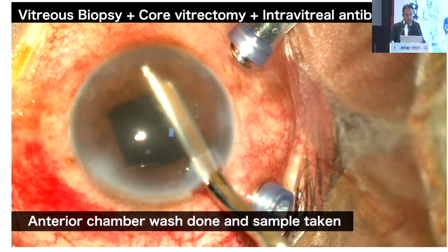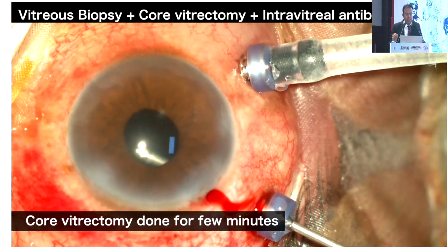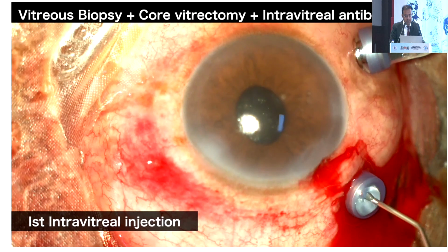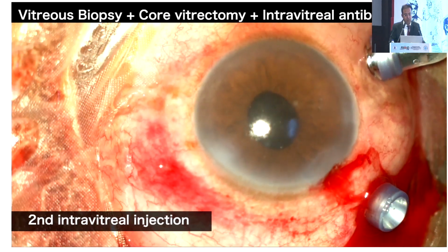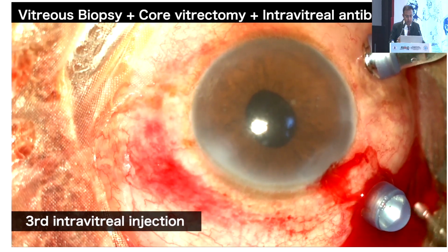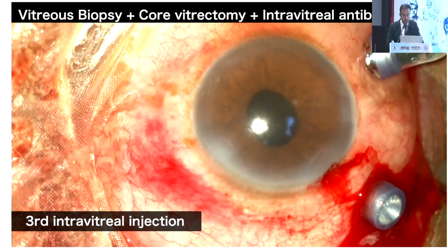And once I've done this, I just go inside. Now, core vitrectomy is nothing. You go inside and do vitrectomy for 3-4 minutes, just like this. Your job will be done. You will have ample space. And now I'm giving the injections. The injections, you need to know which injections are required.